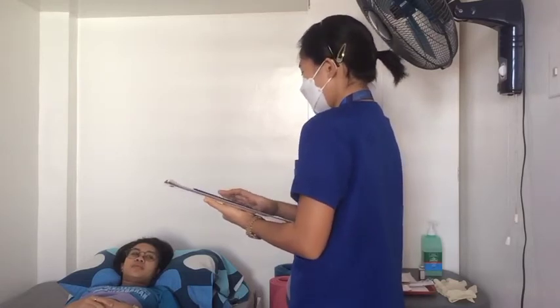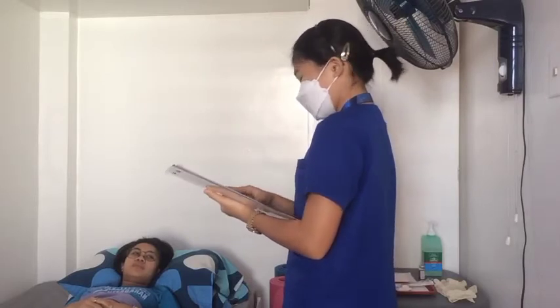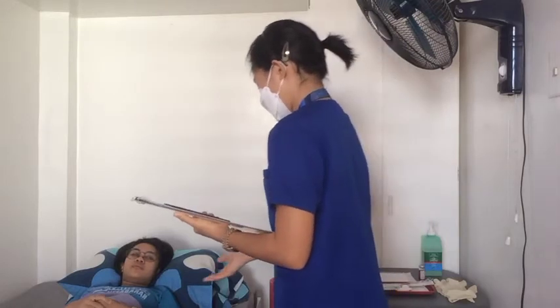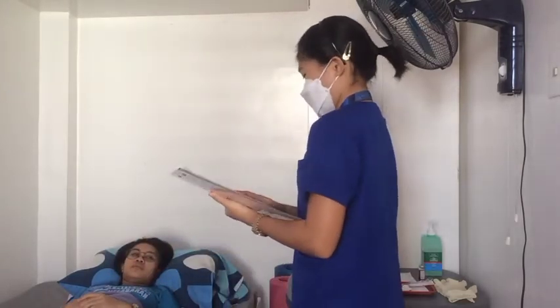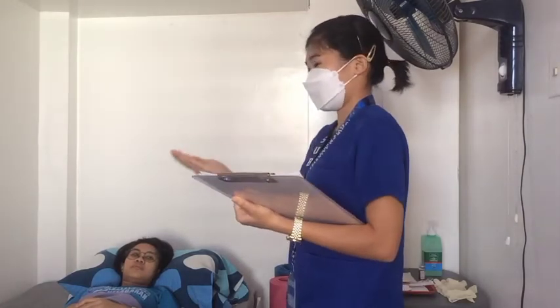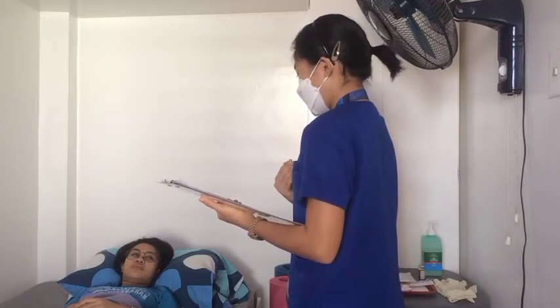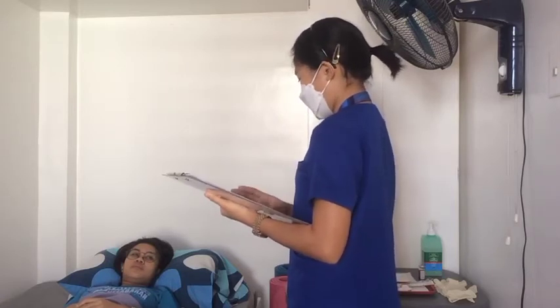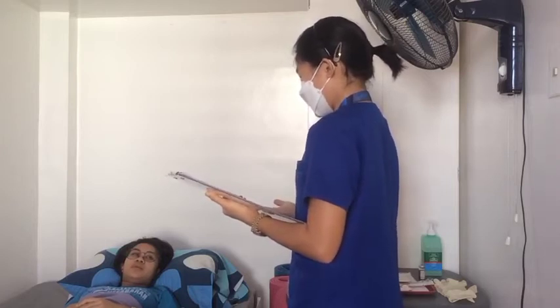Yes. Okay, so this procedure could take 3 to 5 minutes of your time. Is that okay with you? Yes. Okay, may I know if you have any allergies to medications? And also may I check or inspect the side of your arm? Okay, ma'am, thank you. So, I've already washed my hands, prepared the supplies and equipment, drawn the curtains and closed the door. And also, you can tell me immediately if you experience any pain or discomfort during and after the procedure. Okay, is that okay with you? Yes. So, may we now proceed? Yes. Okay, thank you.